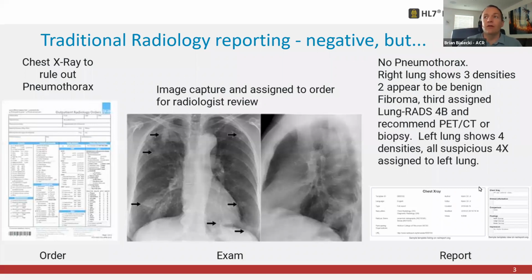They've described all the things that they need to be telling me. But if I am a clinician who needs to follow a recommendation for a biopsy, I'm not exactly sure which arrow pointed to the place where the biopsy was supposed to be done, and therefore it's a little discordant if I'm reading the text as to which arrow describes which item.